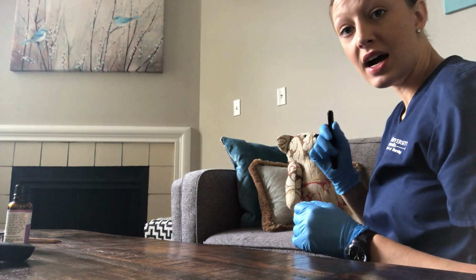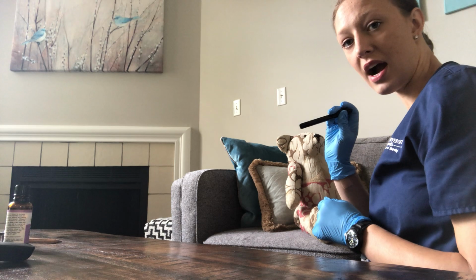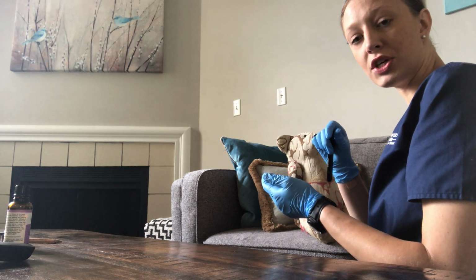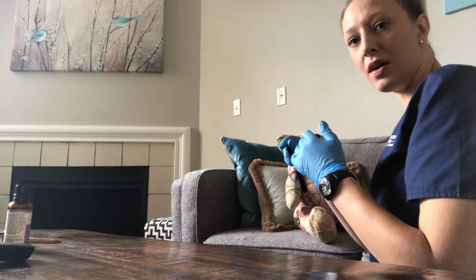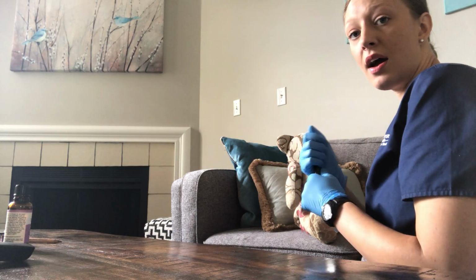Also, while I'm looking at the eyes, I'm going to check for the red reflex by shining the light into the back of their eyes, and there should be a red light that is reflected. And I'm also checking to make sure that the retina is intact and that there aren't any cloudy spots or changes in continuity of the retina.